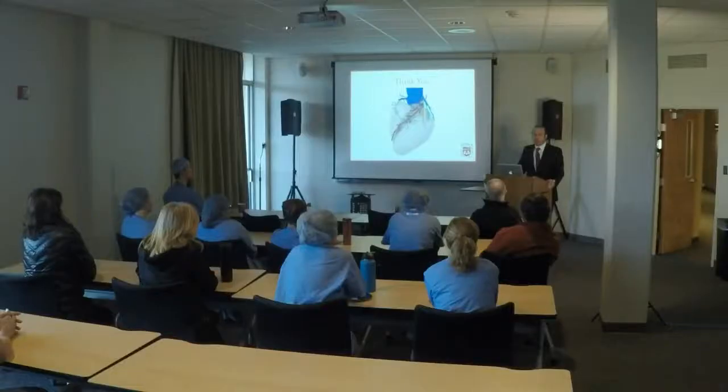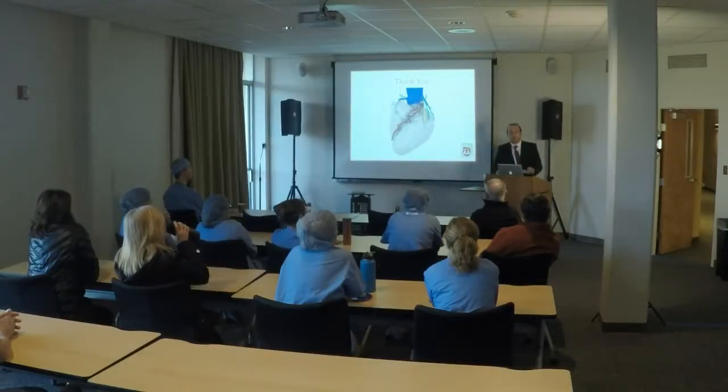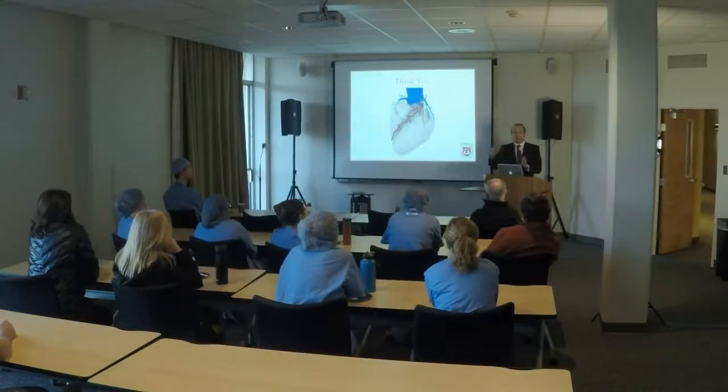And so whether you have an APN, an advanced fellow, a resident, somebody that can get the heart rates down is key. Then it's really important to give the patient nitroglycerin, the sublingual nitro, or the spray. Usually we administer that 5 minutes before the CT scan. And then once the CT is acquired, we have a schedule in place where there's a dedicated cardiologist reading the cardiac portion of the scan, and then the non-cardiac portion goes to the radiologist.